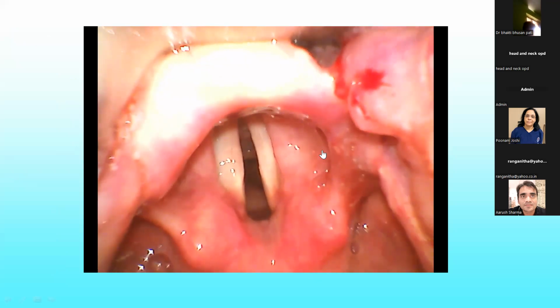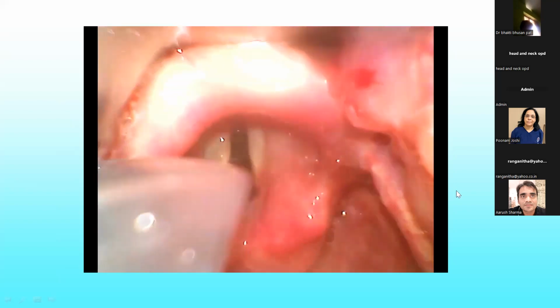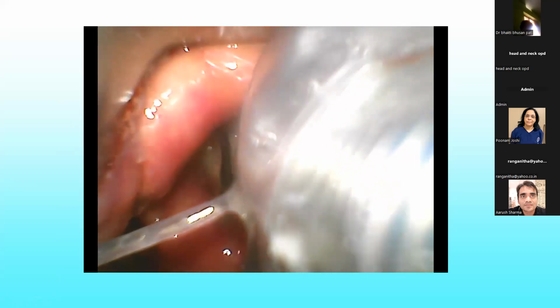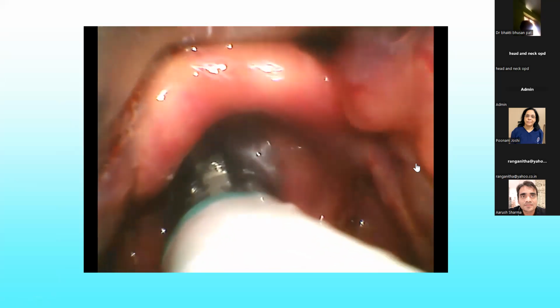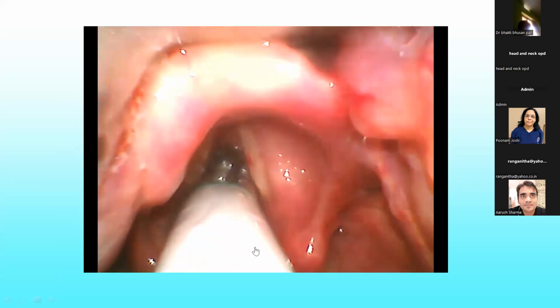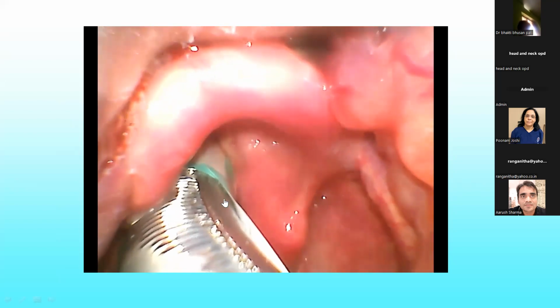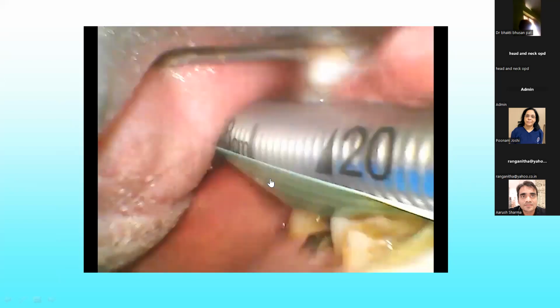So this is the typical video which I can show you, where to place the endotracheal tube during the intubation. This is the typical woman, so we need to place around 19 centimeter intubation area. This is a surface EMG electrode, which we can place, and it has to go a little bit deeper below the vocal cord, because usually the tube position is more important.